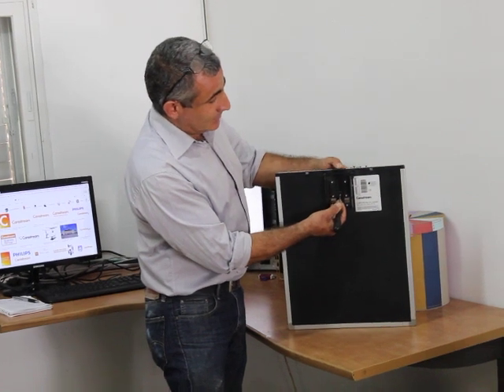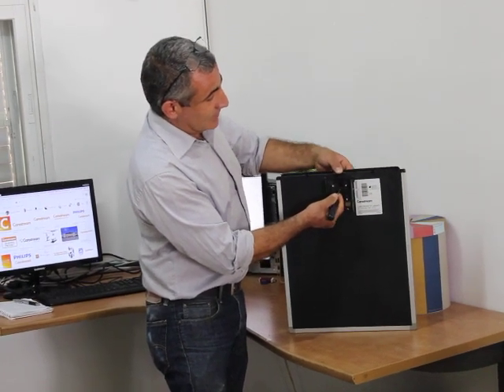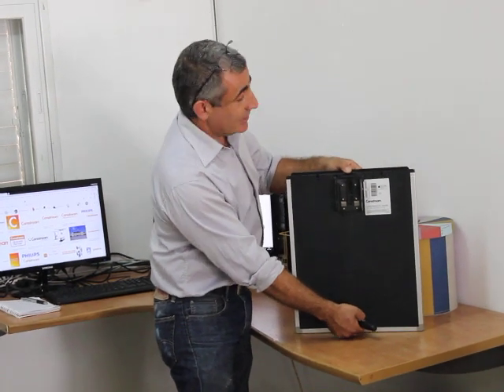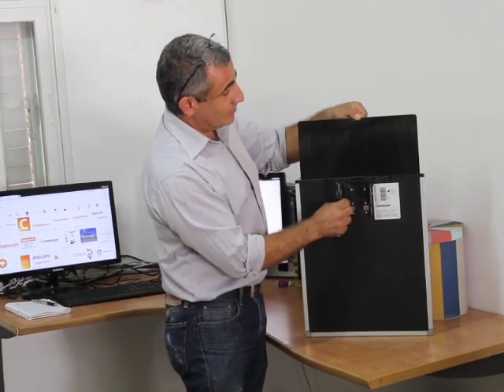Then you take the grip, grip up. The gripper will grip the screen and push it out of the cassette.